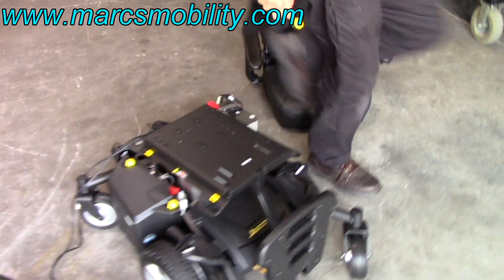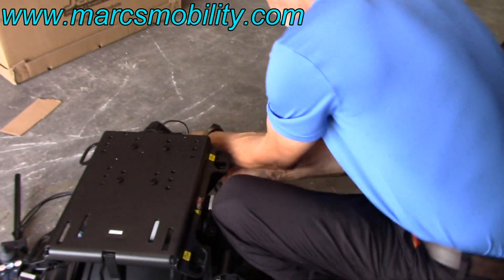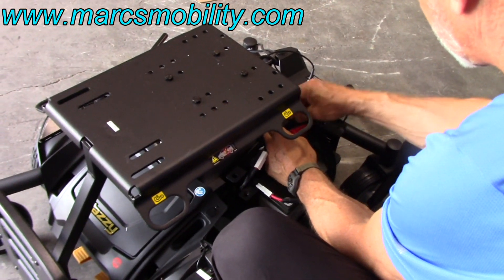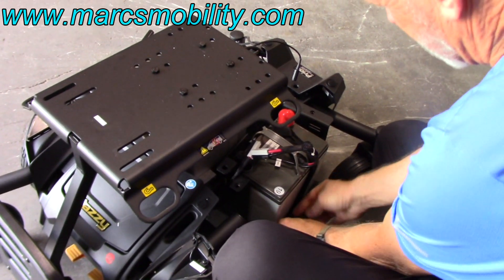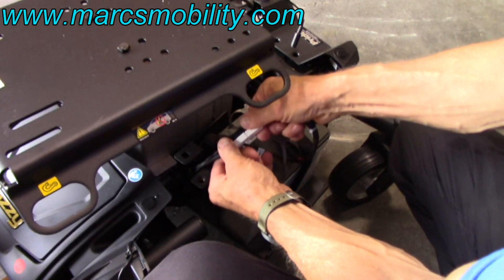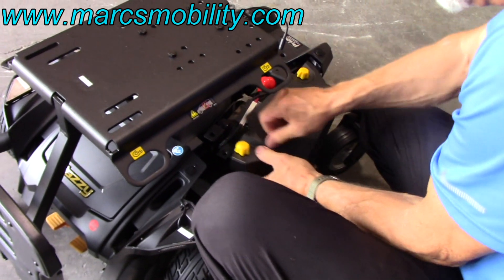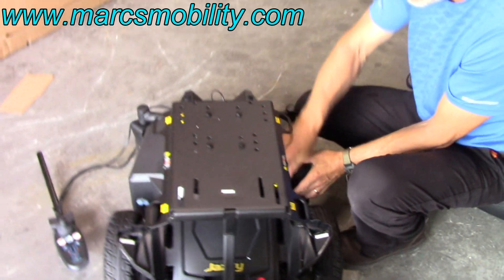Same thing on the other side. Move your velcro out of the way, put your battery in there. You can do the velcro before you connect the power. Put the velcro through the loop right here, bring the velcro back down to the side of the battery, put the extra piece right there, connect your cable again like this. Put your other battery box right on here and turn the knobs. Now you've got your battery cables connected.